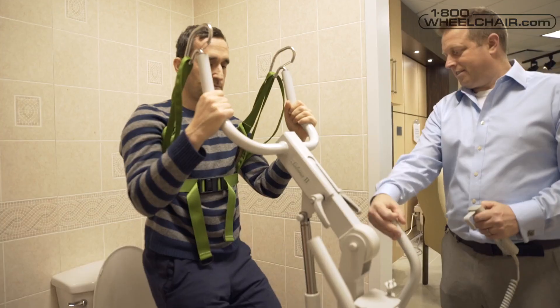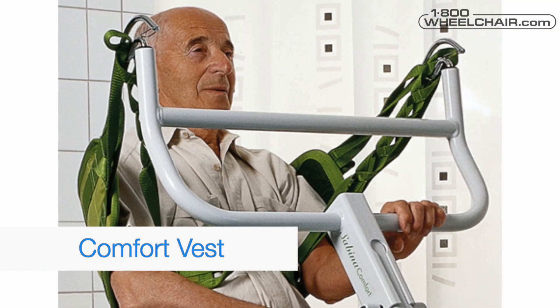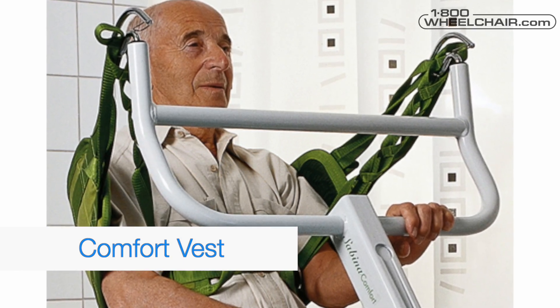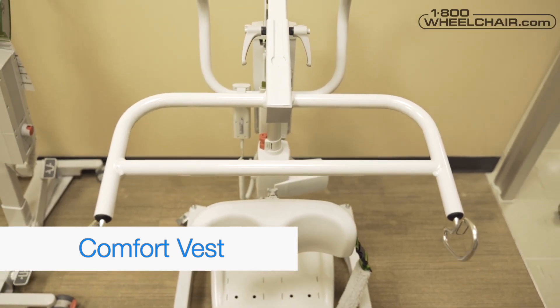The first is a support vest — that's your standard support sling with padding. The second is a comfort vest — this sling is for somebody who doesn't have arm control or has sensitive underarms. Remember, this vest works together with the comfort sling bar.